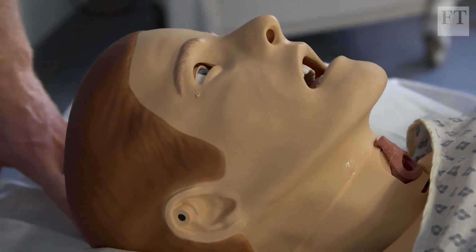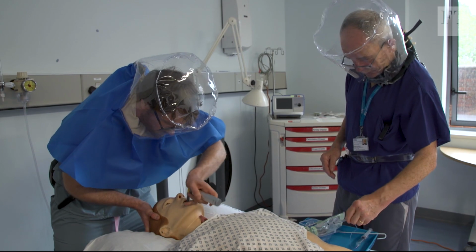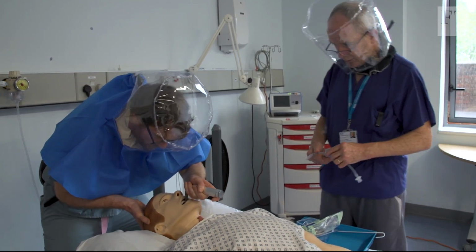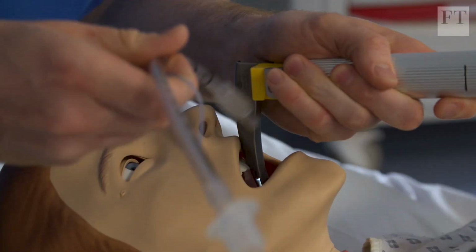So we're just going to simulate an intubation on this mannequin here, just to give us an idea what it's like and how it works. Ready? Yeah. So you need someone specialised to help you to see what you're doing. And then once you've got a view, tube, please. Tube in.